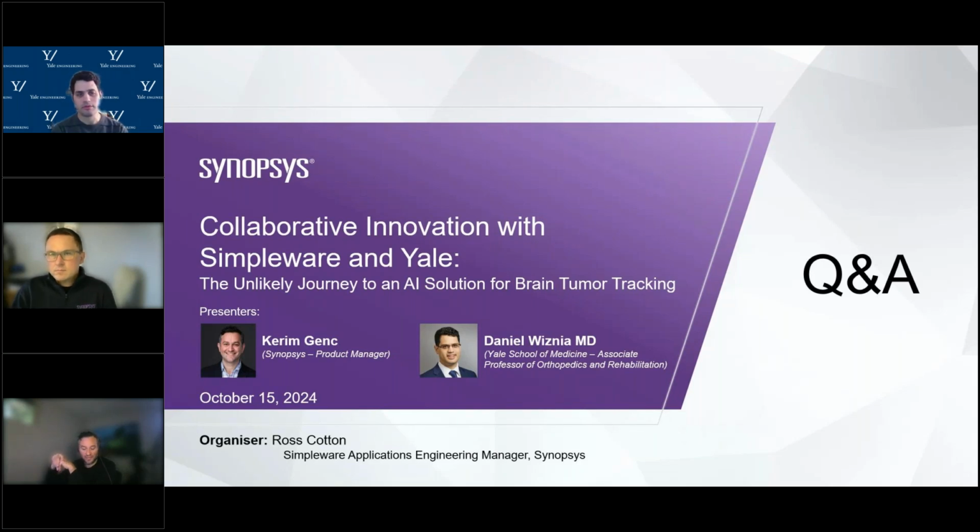So for example, say we did a hip auto segmentation tool. We've had customers where we've done custom solutions for the hip. None of our off-the-shelf tools are based off of that. That's completely theirs, and it's deployed for them and their use only, and they can decide how to use it.